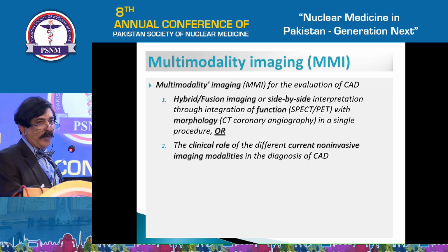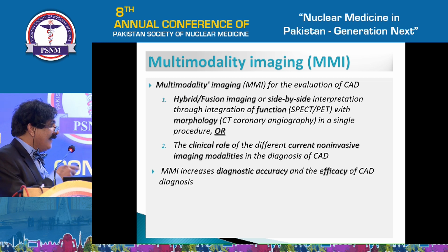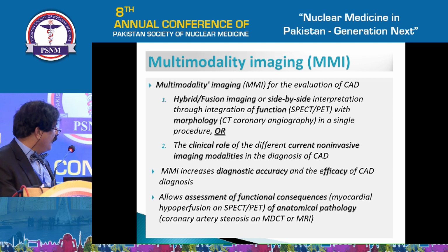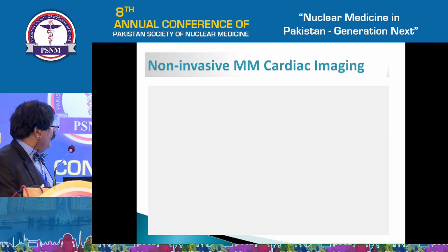You can take what you want, whether they are hybrid or side by side, it's still the same. What it does is increase the diagnostic accuracy and efficacy of the coronary artery disease diagnosis and allows assessment of the functional consequences, such as myocardial hypoperfusion on SPECT or PET, of anatomical pathology such as coronary artery stenosis.